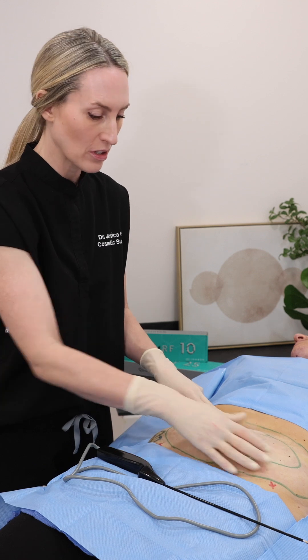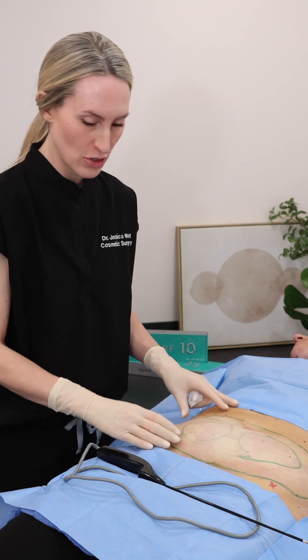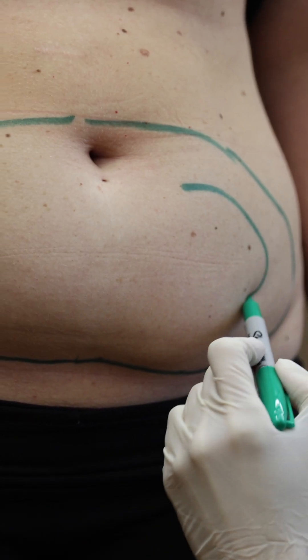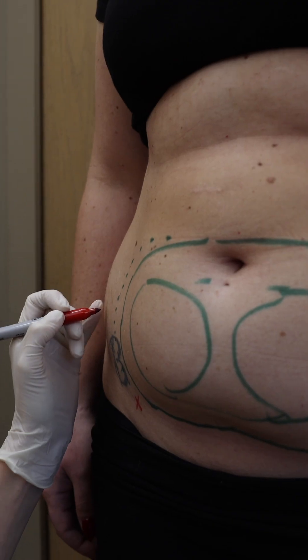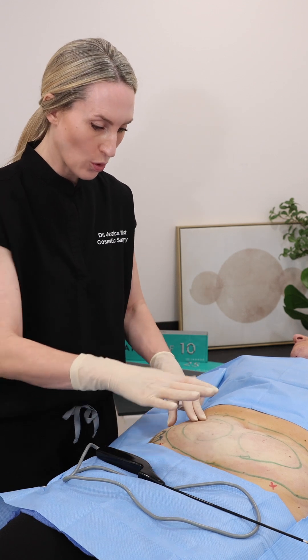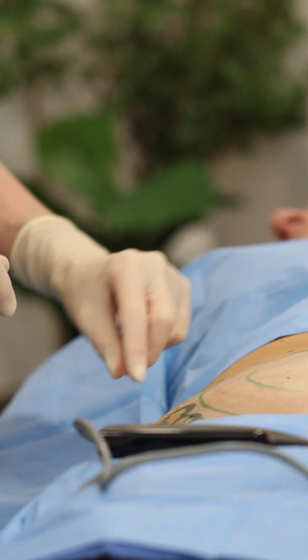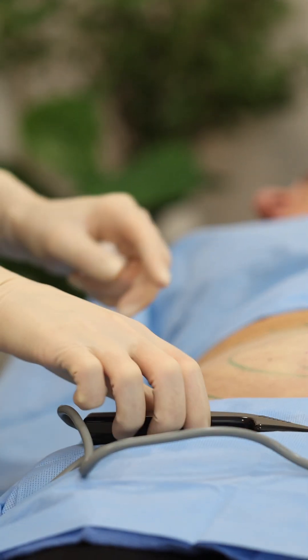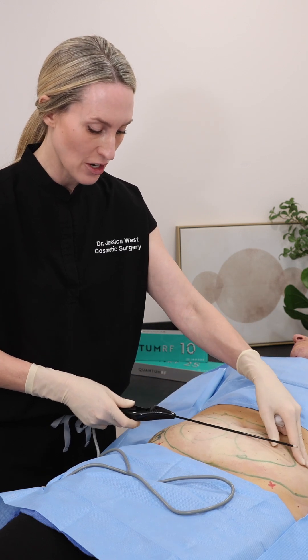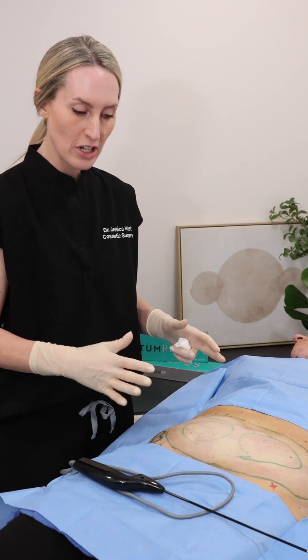We've infiltrated the area with Klein solution, double strength. You can see here I've marked out the area of adipose tissue that we're wanting to treat, with the apex of the tissue being in these two circles here. We've marked two lower incisions that you can use if you want to keep them outside of the bikini zone or hide within bikini or underwear. We also have another option for an incision site — because this is a longer probe, I'm able to access the entire treatment zone through one lateral incision.